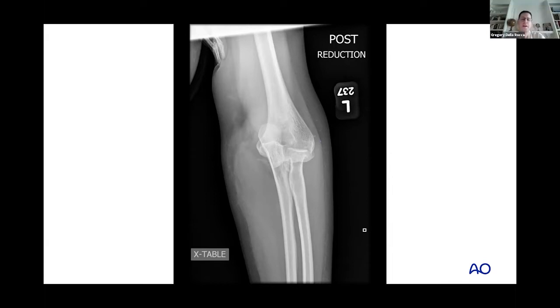Yeah. So another thing that Jonah didn't exactly point out. I mean, he did. You do see there's a lack of splint. You see there are a couple of digit tips there on the medial side of the humeral shaft. But what most of you will notice is that it's a pretty good AP of the distal humerus, and it's a pretty good AP of the proximal forearm. And so that's an elbow that's extended.